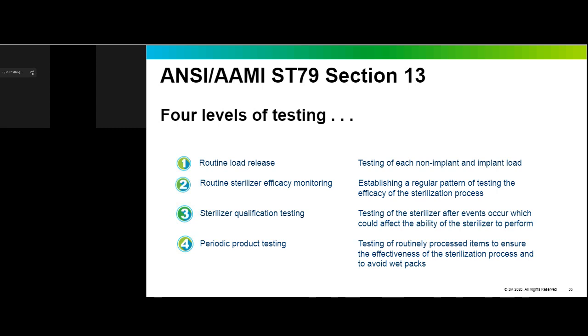Then there's sterilizer qualification testing. That's the testing that we do after a sterilizer is newly installed or has a major repair, to make sure that in our clinic or surgery center, with our water or steam supply, that vessel is working properly. And then periodic product testing. That's a concept where you take an item that you routinely sterilize and make sure that with your packaging and your sterilizer, you're getting good results. So in this session, we're focusing only on the top 3, and these are what I do see very well practiced across the country.